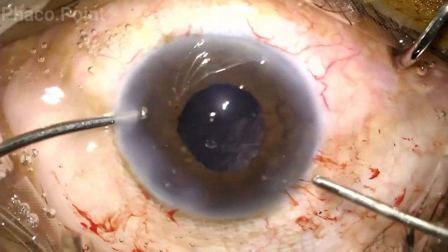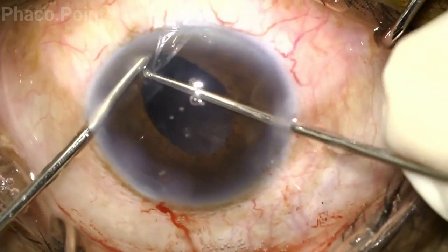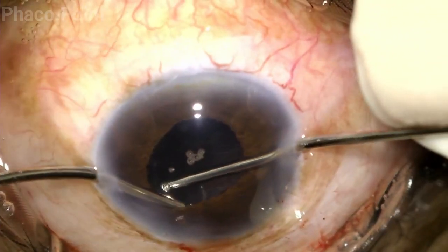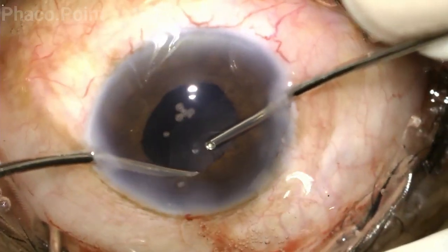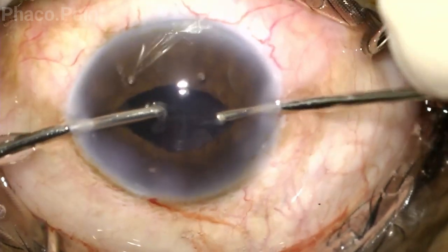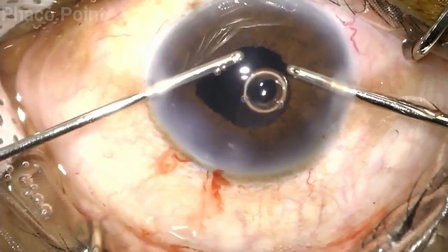Coming to the irrigation aspiration — bimanual irrigation aspiration is by far the most superior technique to actually remove the cortex. Not only is it easier to remove the cortex circumferentially, but the irrigation cannula acts as a retractor which aids visibility of the cortex, which can sometimes be a problem in these small pupils.